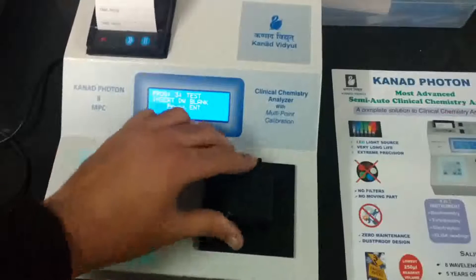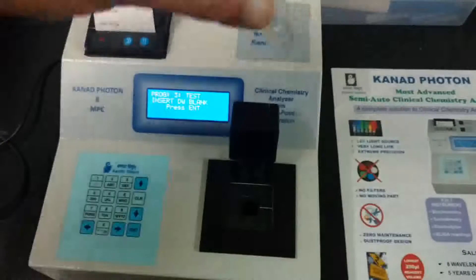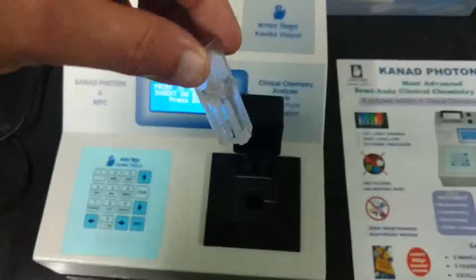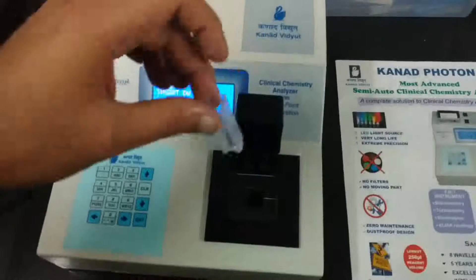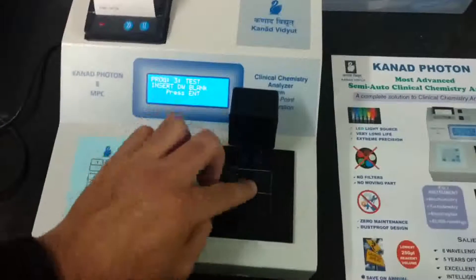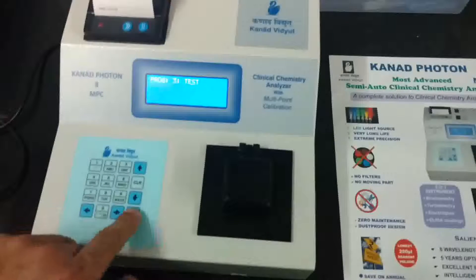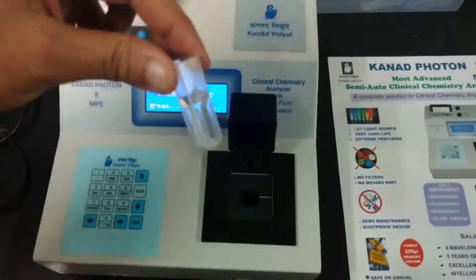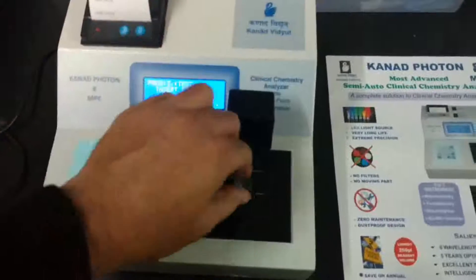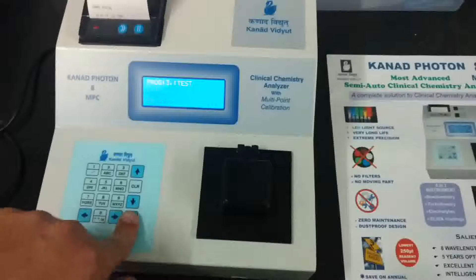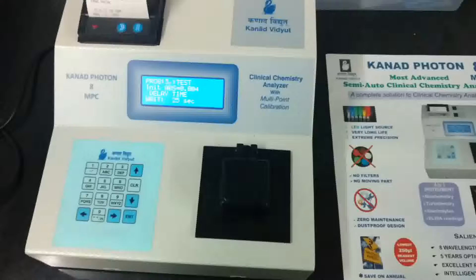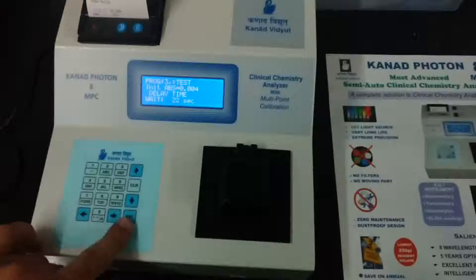The machine has now reached 37°C and is asking for a distilled water blank. We are using semi-micro cuvettes — 100 cuvettes per box — which come with the machine. I will place the cuvette inside and press Enter. This is the standard step; the machine will now ask for the standard. We are providing distilled water here just to demonstrate how the machine performs. This is how any test will be run.